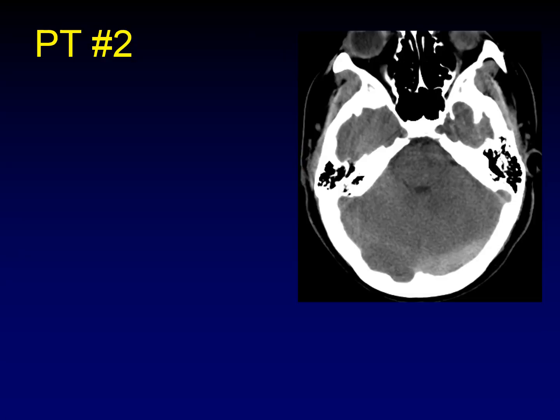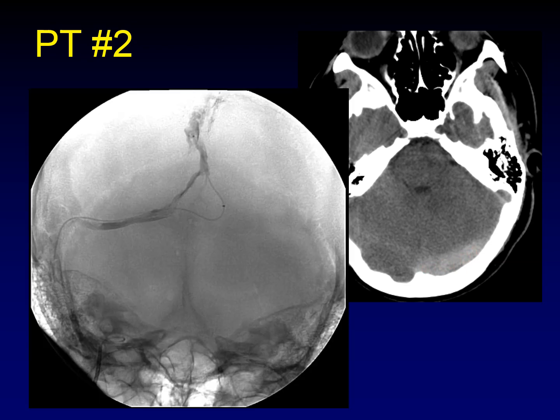Now let's look at patient number two — maybe she'll be okay too. On this unenhanced CT, there is increased density along the transverse sinus. That's acute thrombus. The conventional venography shows flow down the superior sagittal sinus and into the right transverse sinus, but absolutely no flow into the left transverse sinus. This is acute clot.